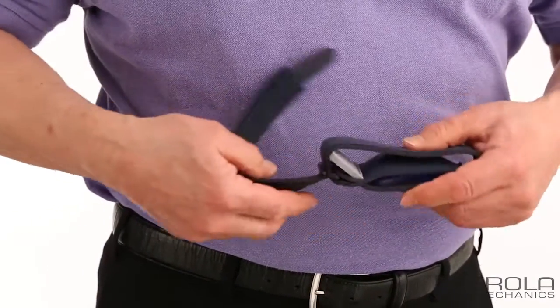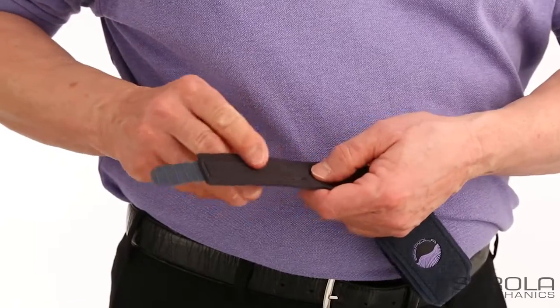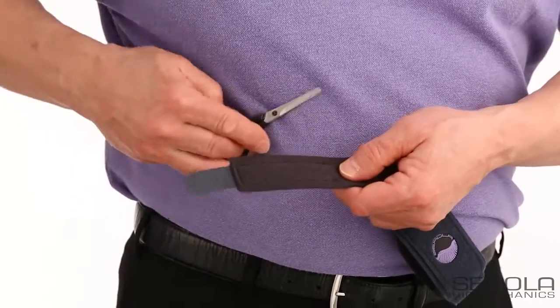You can see that the lengthwise stitching that holds down the hook tab stops here, but the tab itself actually goes farther.